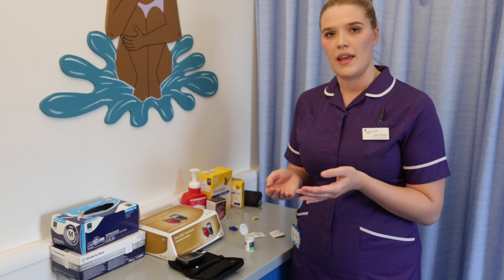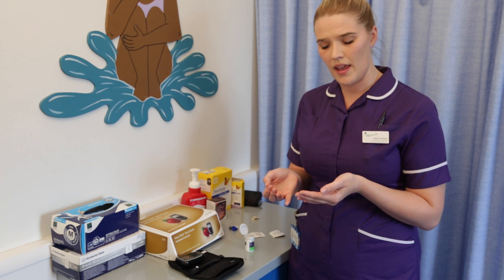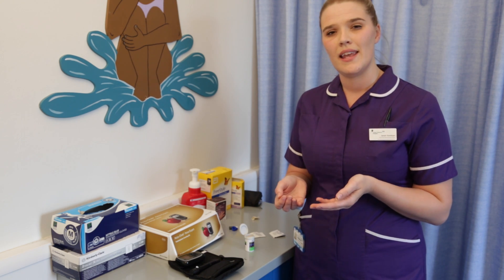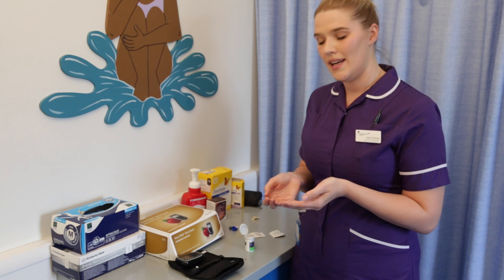The reason that we ask you to do this is because if you have touched anything before a check, it can leave remnants on your fingers which could give us a false reading. Also if you are checking with wet hands, it can give us a false low reading by diluting it. It is very important that your hands are clean and dry.